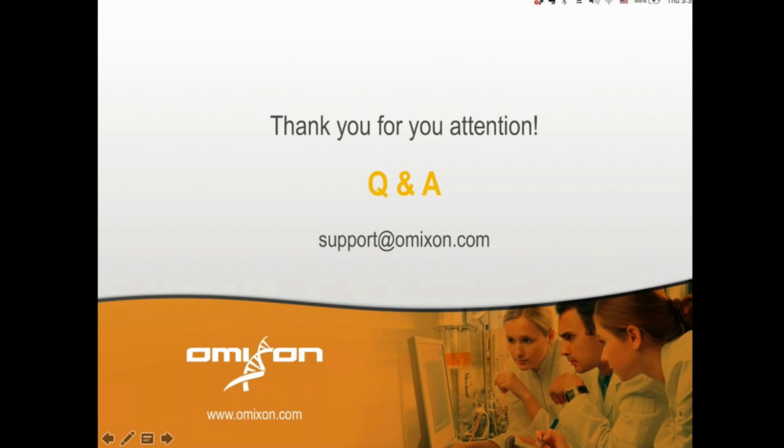Thank you, Libor. I have another one here. It says, how often is the database for HLA typing updated from IMGT to Twin? Do you want to answer it? Yeah, I can answer that.